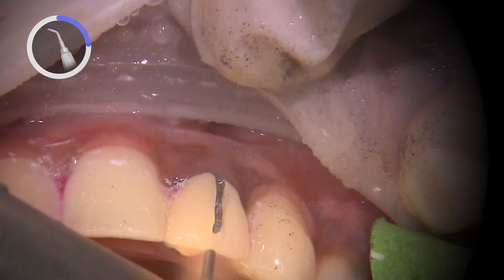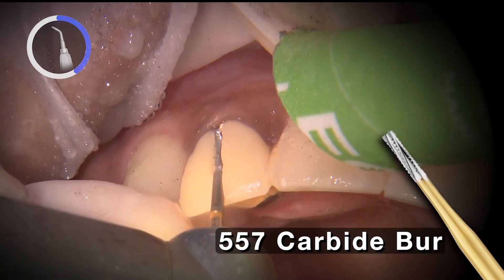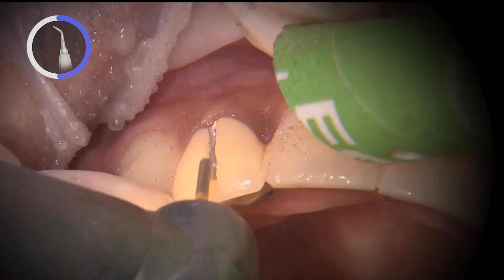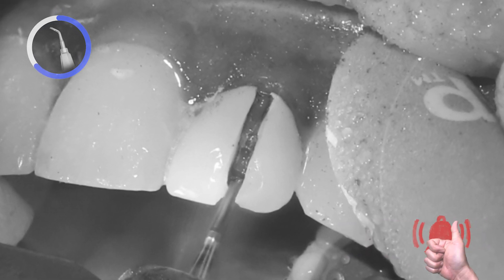We'll start with the removal of the PFM crowns, where I use a carbide 557 bur to create a slot through the crowns along the facial, incisal, and lingual surfaces. It's pretty easy to tell once we've cut through a PFM since the transition from metal to tooth prep beneath is pretty obvious.